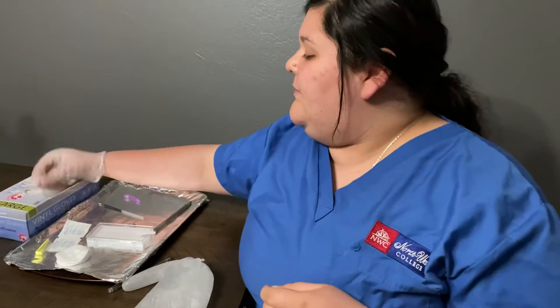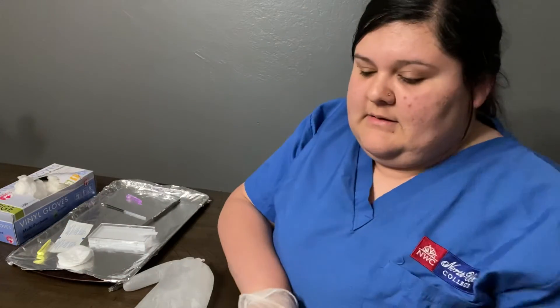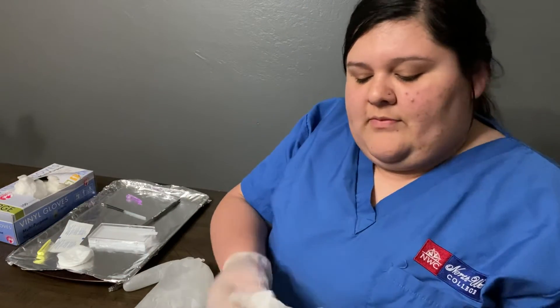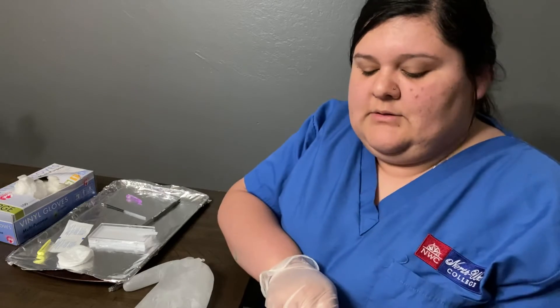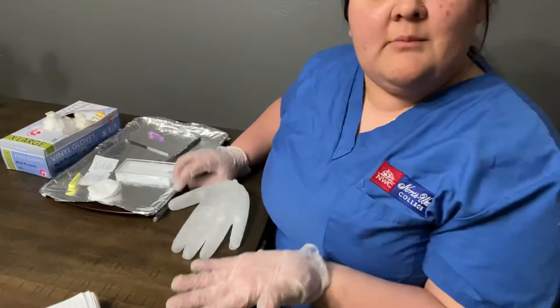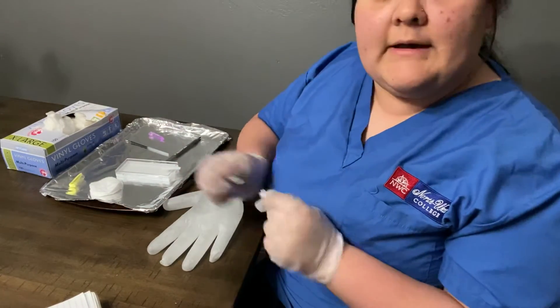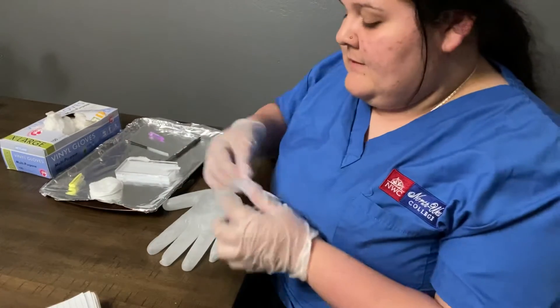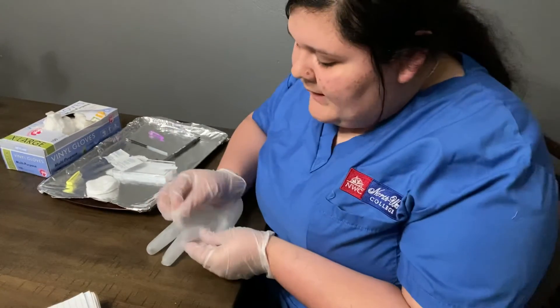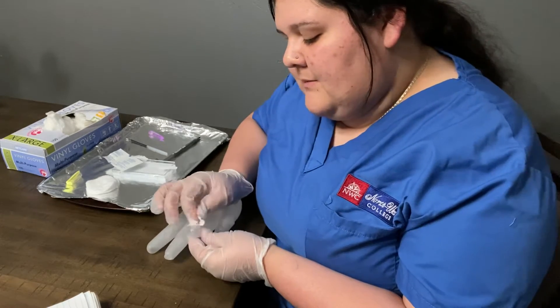Now that I'm putting on my gloves and my hands are clean, the goal is to have enough blood to get three tests done so I don't have to poke the patient again. So here's the patient's hand, with their arm facing like this. I'm going to want to use the ring finger and get an alcohol pad to prep their finger.